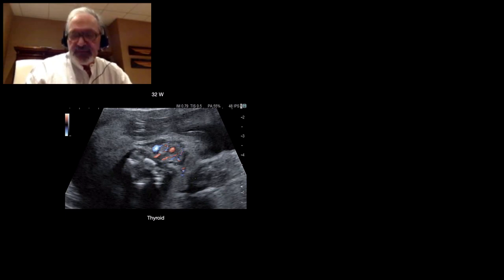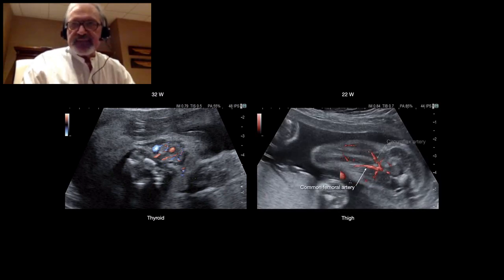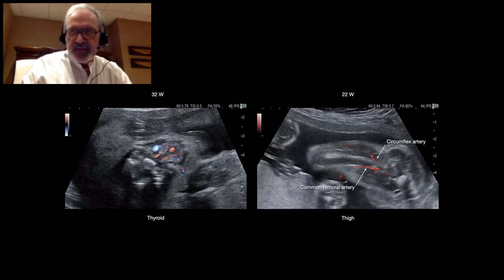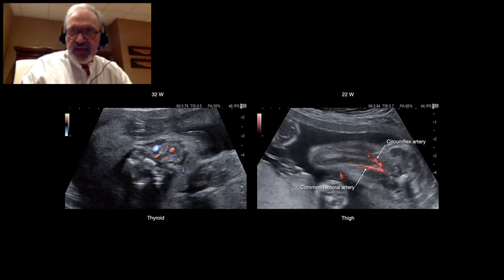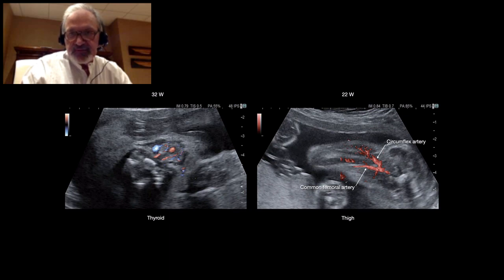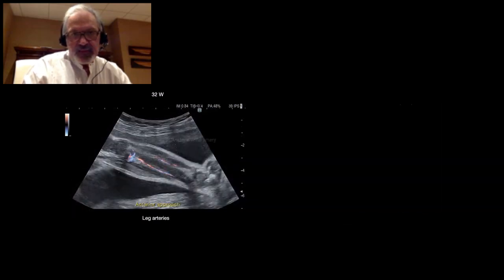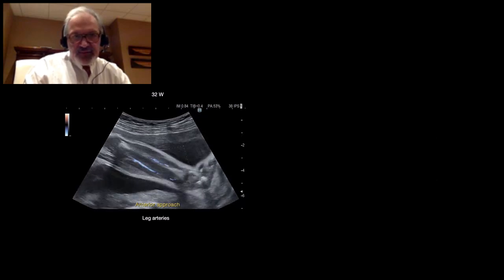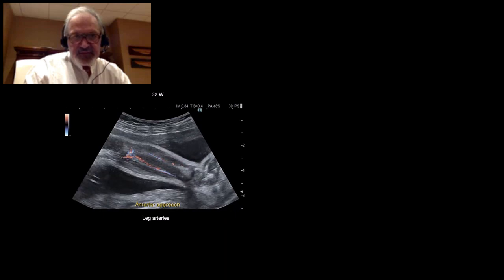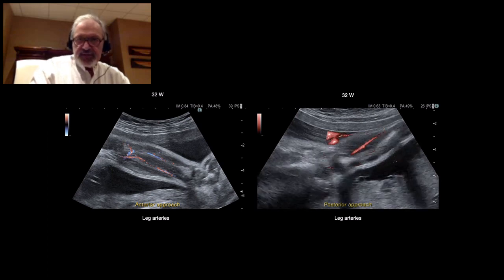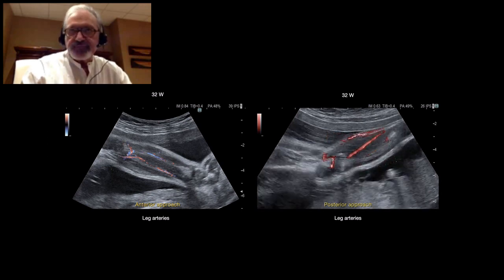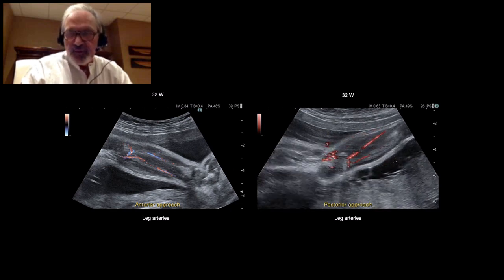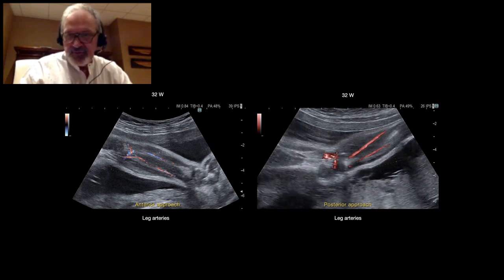Another example: at the thigh, we can recognize the common femoral artery and the circumflex artery, as well as the perforating arteries in the muscles — these are very, very small arteries. To the leg, we have anterior and fibular arteries. We can follow these vessels very easily in the anterior approach, and with the posterior approach, we have very good resolution for these very small vessels.